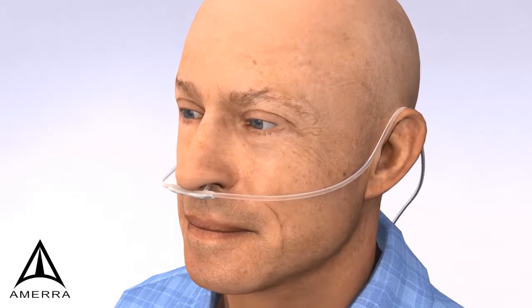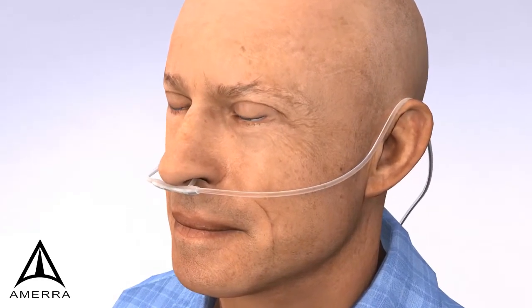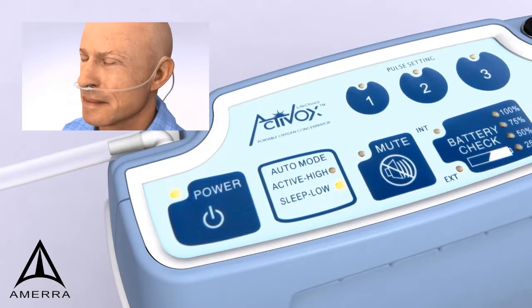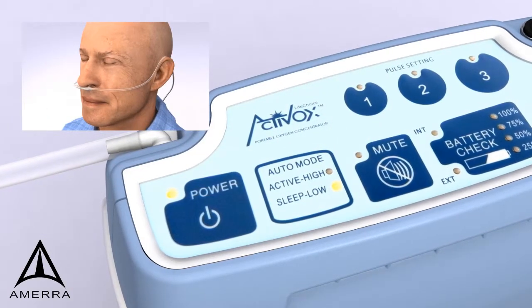It is equipped with auto-mode technology, which detects changes to the patient's breath rate and automatically adjusts the delivery of oxygen during periods of activity when breath rates are higher and periods of sleep or rest when it is lower.